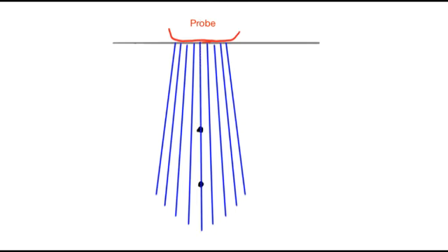And that's what you do. And so there are these little piezoelectric pressure objects, transducers they're called, in the probe, many of them, and you can electronically control them, scan back and forth, and get these different lines that will give you an image. And then that's the one dimension. And the other dimension, you can move the probe back and forth, or sometimes you can do it electronically as well. Okay, so maybe I told you how an ultrasound image is made. So those are the basics of ultrasound imaging.